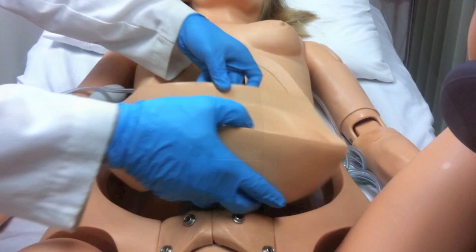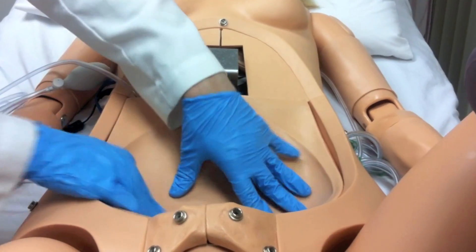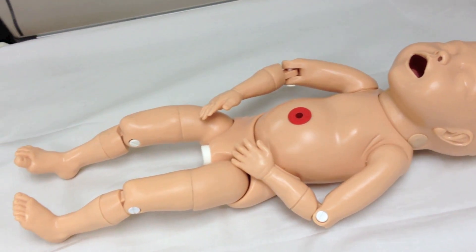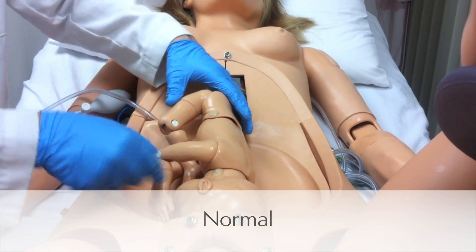NOEL comes with an inflatable base that, when placed into the abdomen, lifts the baby to facilitate Leopold maneuvers. The birthing fetus is highly articulate and can be placed in transverse, normal, or breech positions.